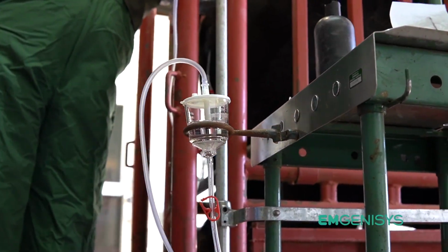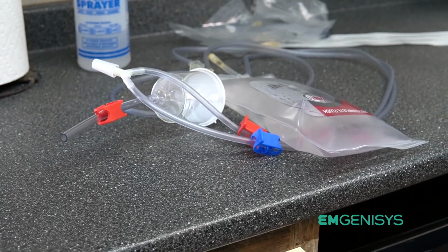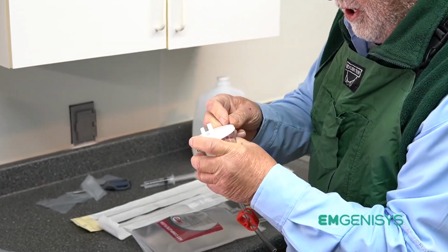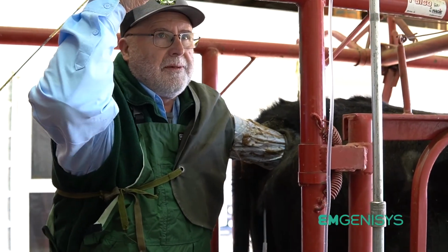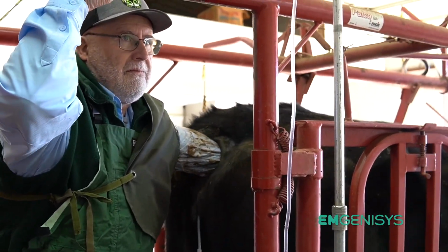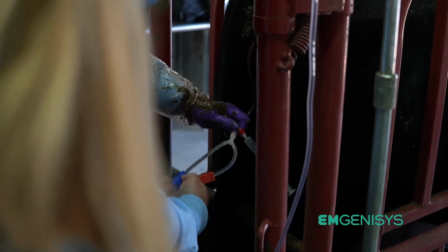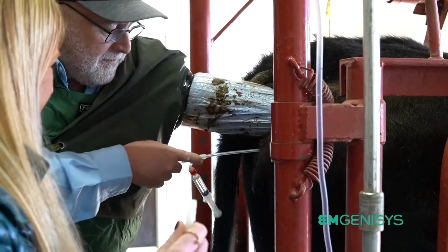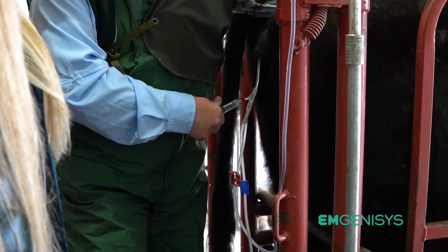Once the catheter is in the proper position, saline solution is allowed to flow into the uterus. A Y-shaped connector is used to allow the media to flow into the uterus and then back out another line and into a collection cup with a filter to trap and recover embryos. During this process, the veterinarian will massage the uterine horn to encourage the release of all embryos with the return of the fluid. Once the veterinarian is satisfied that the horn was properly flushed, he will reposition the catheter into the other horn and repeat this procedure on the other side.